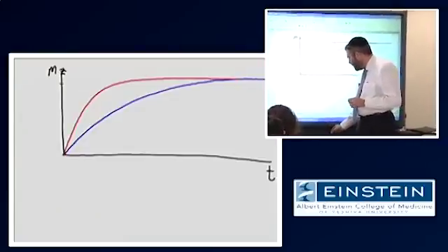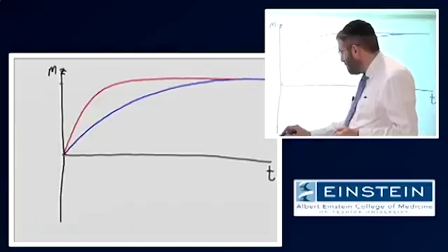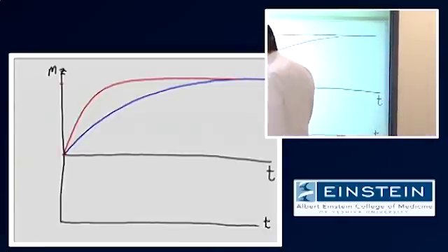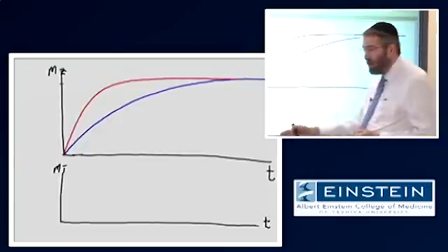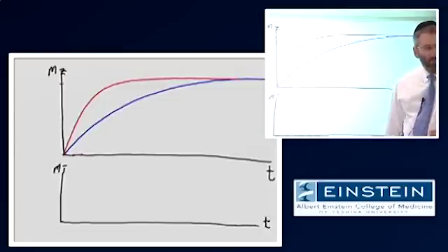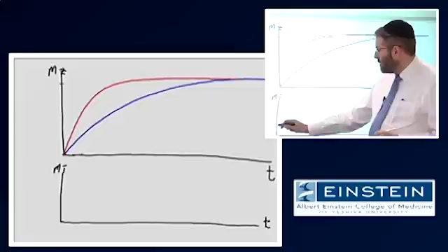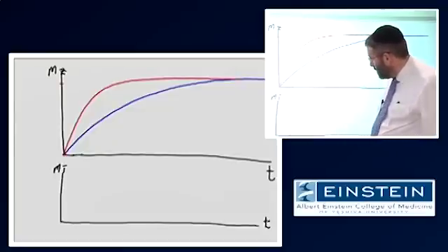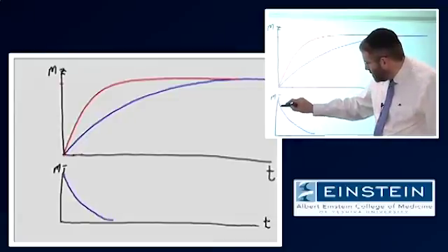Now, we said before that at the same time, and what I'm doing here is just, in parallel, because this is on the same time scale, I'm going to show you below what's going on with transverse magnetization. Okay? So where are we at this point in time? Right? Exactly, we're at our max. So if we draw our 2 different tissues in here, we're going to have something like this and something like this.